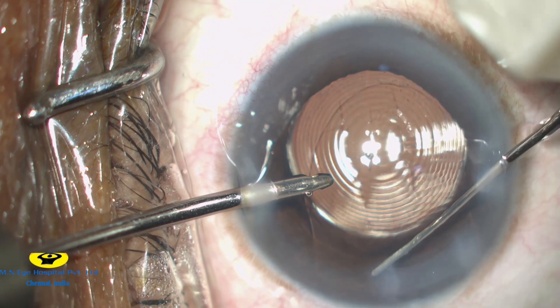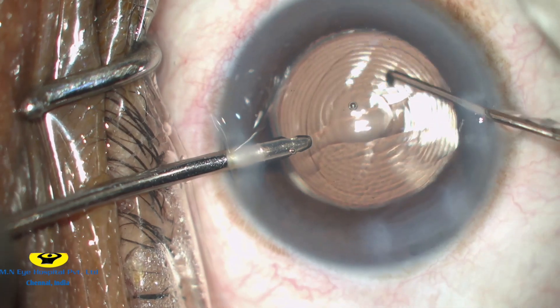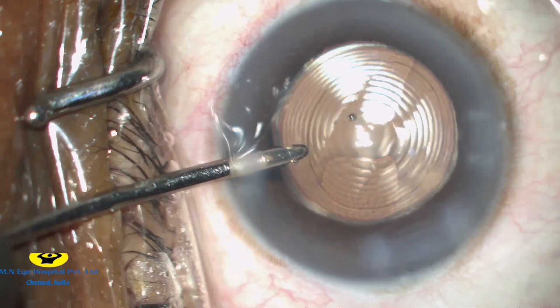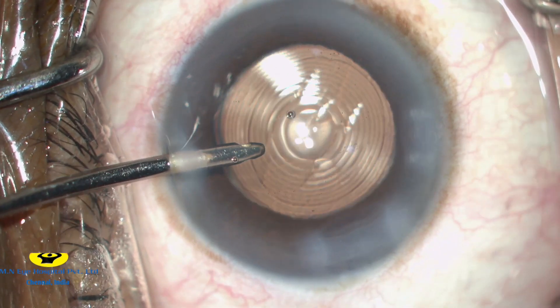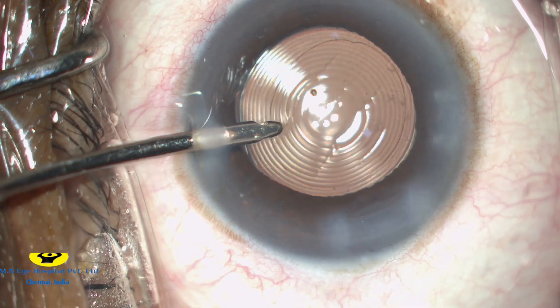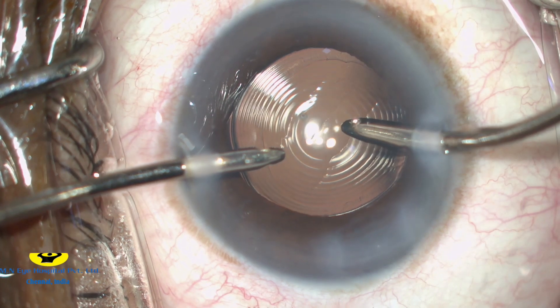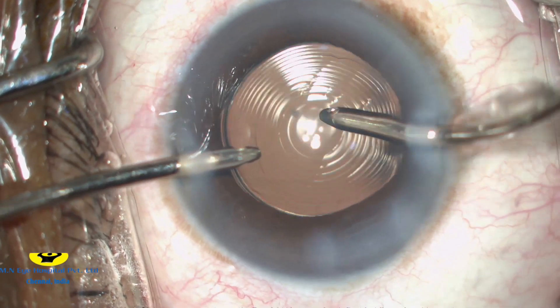The trailing lens haptic is then tucked underneath the anterior capsular rim. As you can see, there is very good overlap of the anterior capsular margin over the intraocular lens. This ensures good centration and avoids tilt of the IOL, which is essential in these trifocal intraocular lenses.